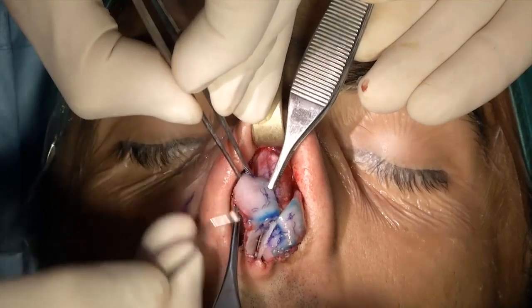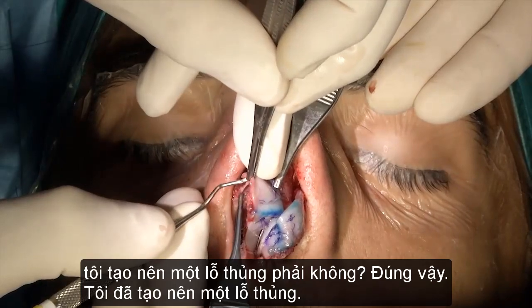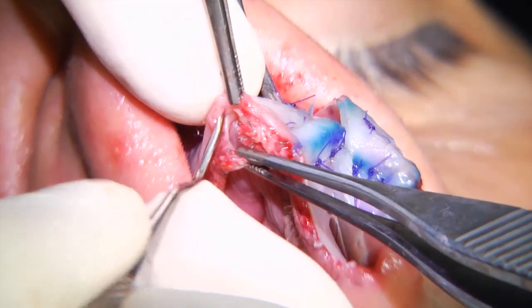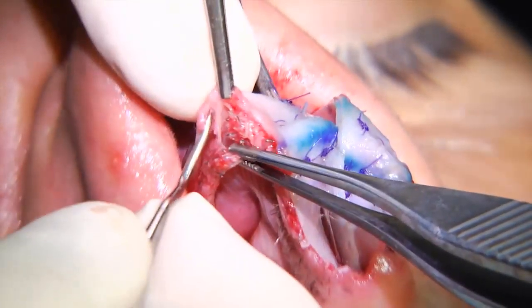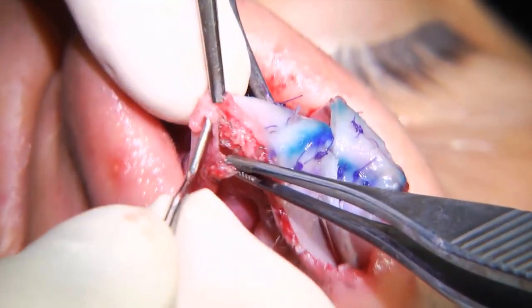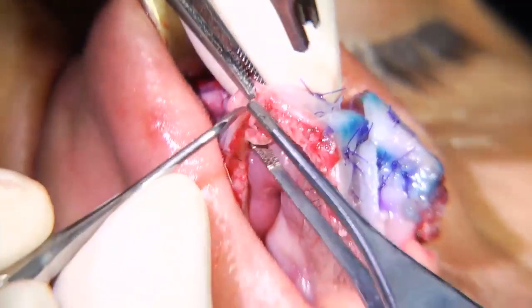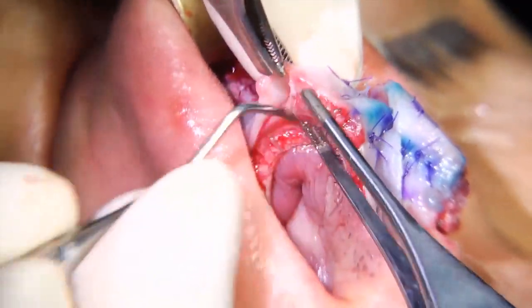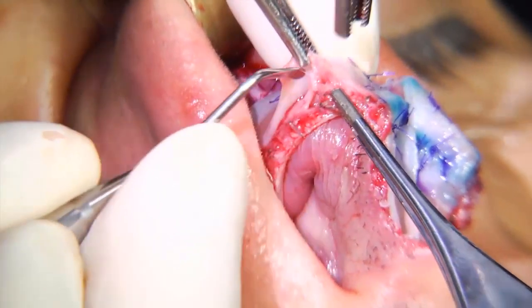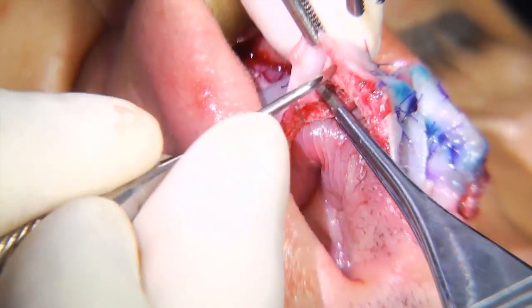There we go. Did I make a hole? Yes, I made a hole. Attenzione. Fammi la lama. I have to repair this hole. Giralo. Careful here, careful. Tieni. Prendi la mucosa. Da quella parte. Sì, va bene così.